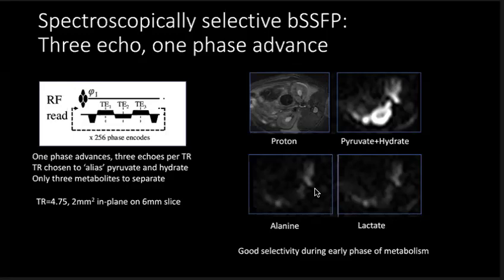So, this is something that the oncologists are pretty interested in. They're interested in response and resistance to targeted therapy in cancer. And something that Leo Tsai and Gerhard Wolf over at Beth Israel Deaconess have been bugging me about for years is to be able to look at the heterogeneity within the tumor. And I think the hope is that some of these high resolution imaging techniques, together with some of the quantitative imaging techniques, might enable us to begin to do that.